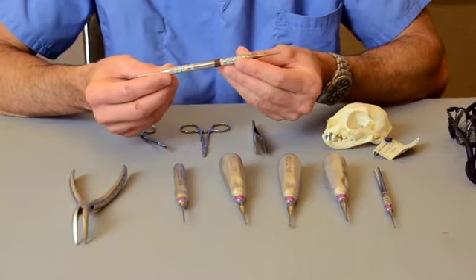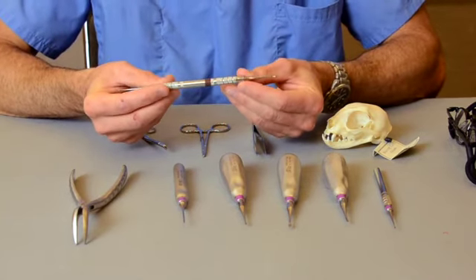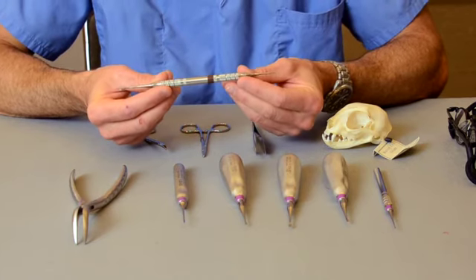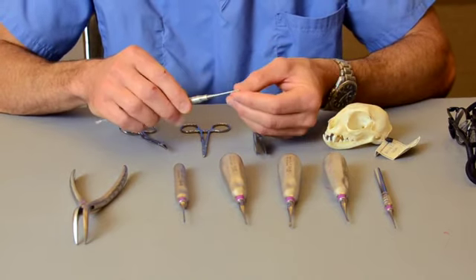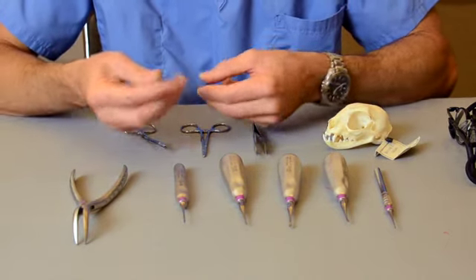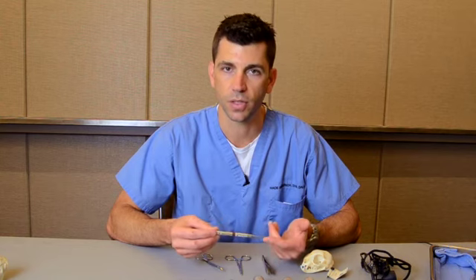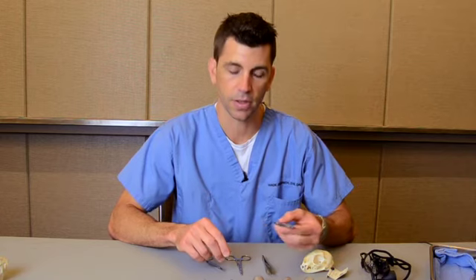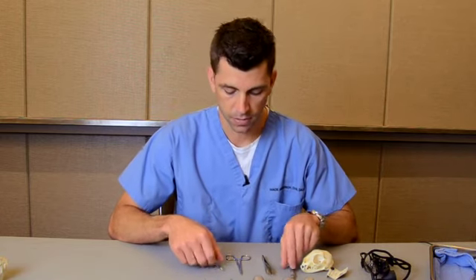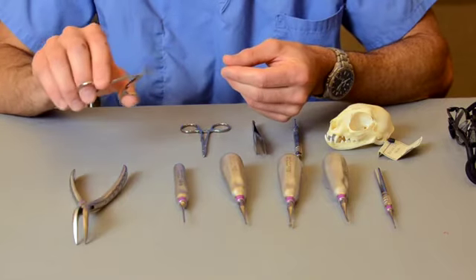A fine periosteal elevator is also very helpful. And this one is made specifically for dogs and cats. I use this in small dogs, I use this in cats. It's got two ends, one is smaller than the other. This is the larger size. And it's a periosteal elevator. This instrument is for lifting the mucogingival flaps during a surgical extraction or following an extraction to create a flap for closure. So a small or fine periosteal elevator is a definite necessary piece of equipment for any feline extraction pack.